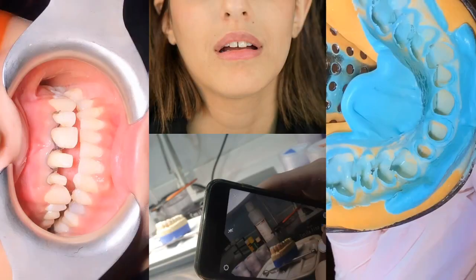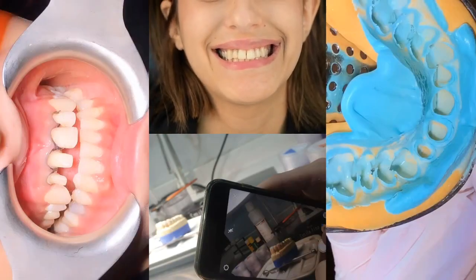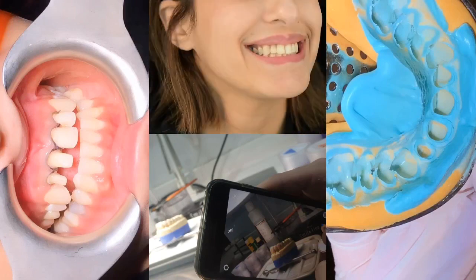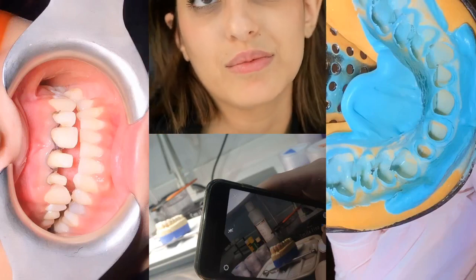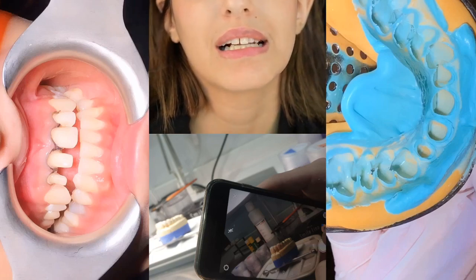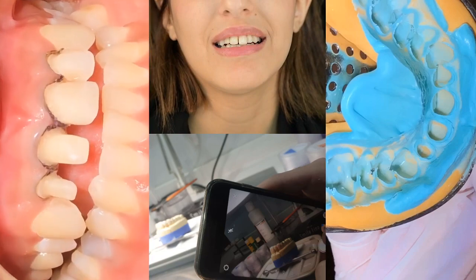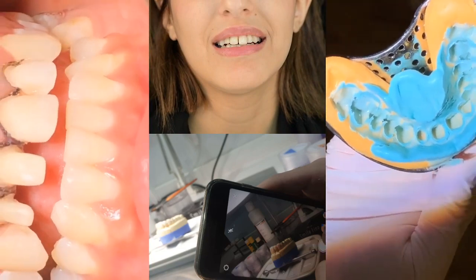And what about the clinical cases? We are going to see together the clinical cases at my dental office. You have to let your patient explain their desires before starting. And this female patient wanted her central incisors to have the diastema closed and to be a matching shade and shape. And this is after preparation, and that is the impression.